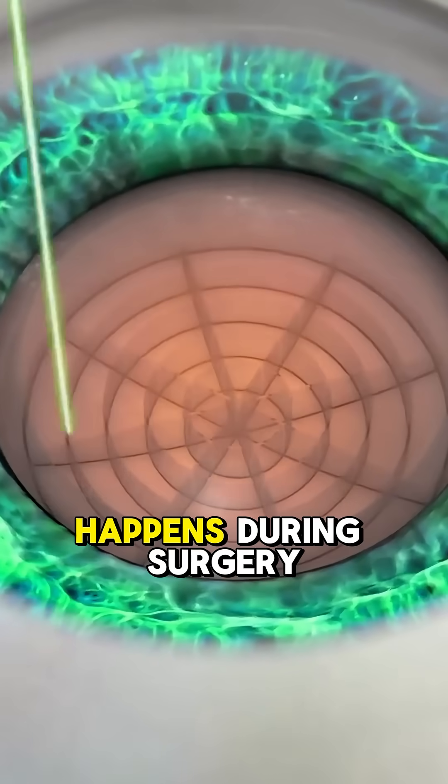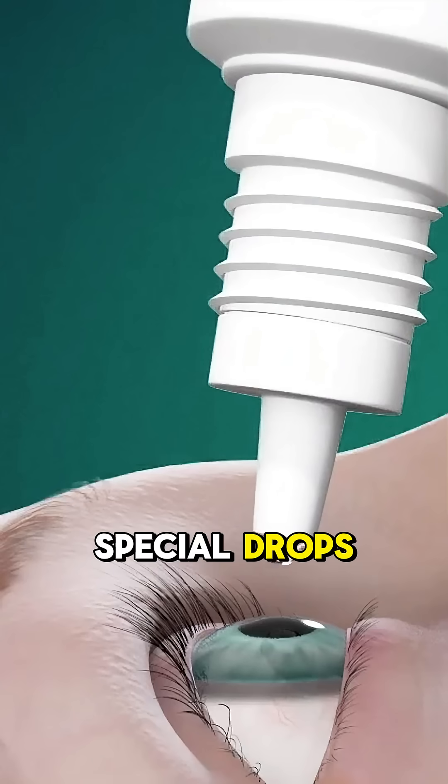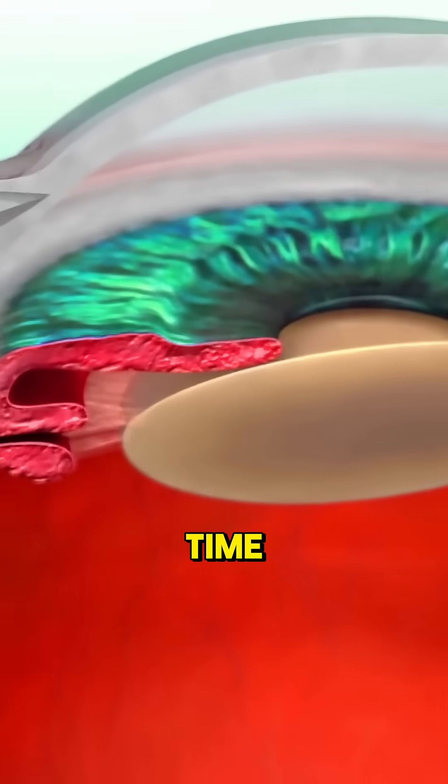So, here's what happens during surgery. First, your eye is numbed using special drops — no pain, just a little pressure. And yes, you're awake the whole time.